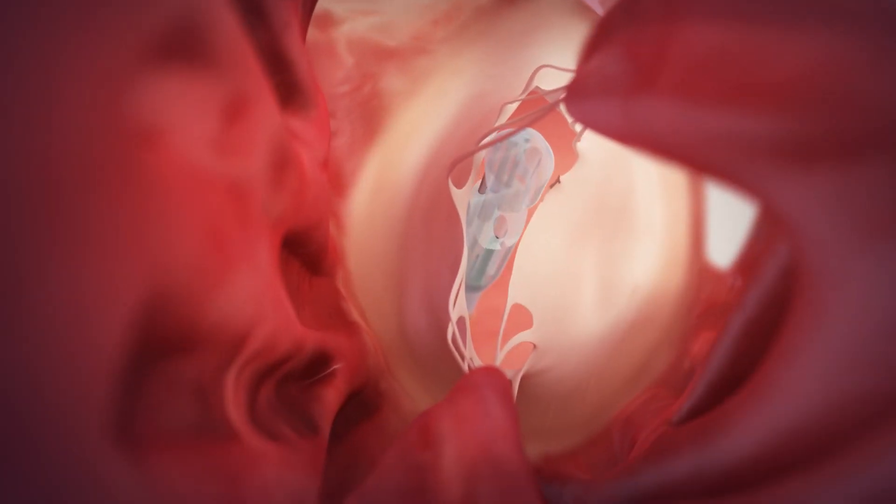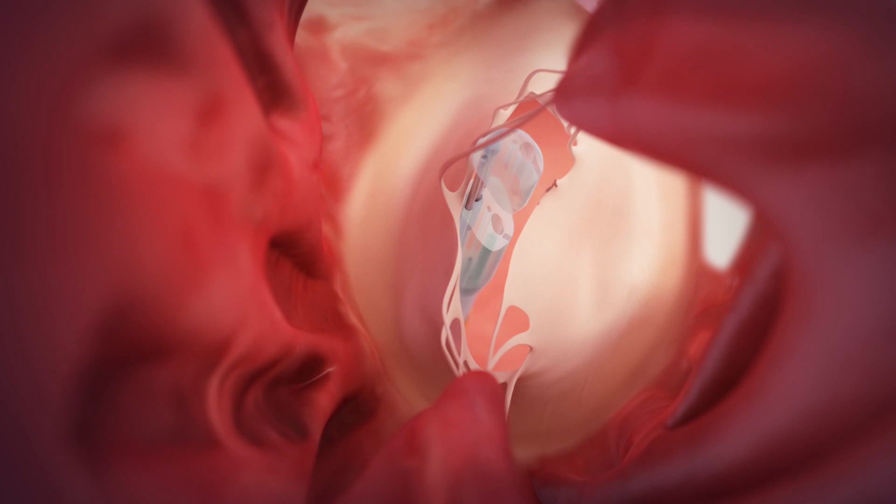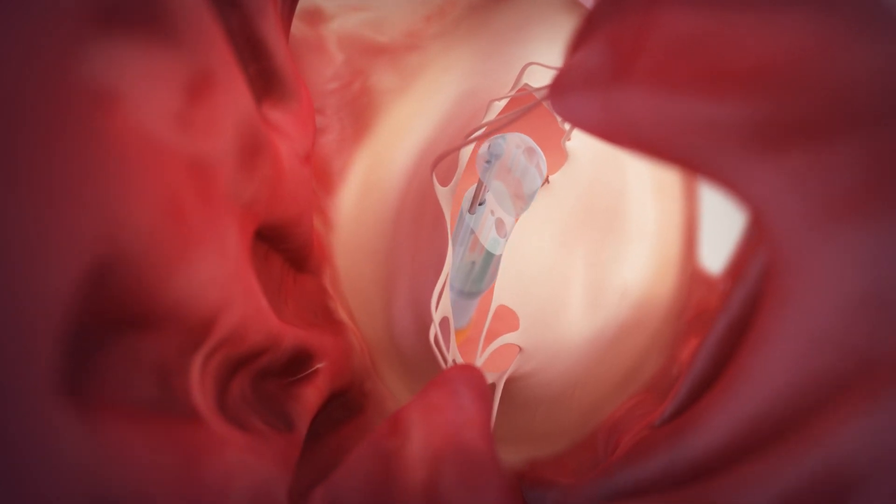The grasper is guided to face the respective part of the leaflet using fluoroscopic and echo guidance, and is then closed to grasp the leaflet.